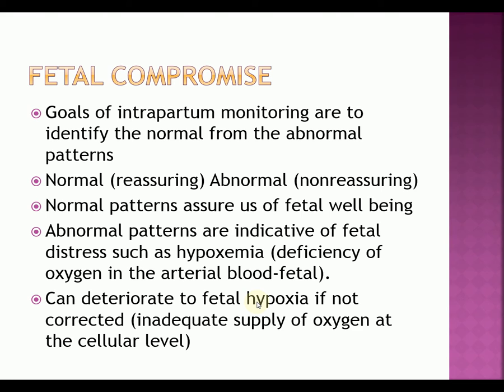the goal of monitoring a patient when they're in labor is to identify the normal from the abnormal patterns.